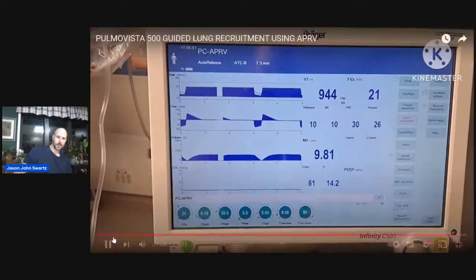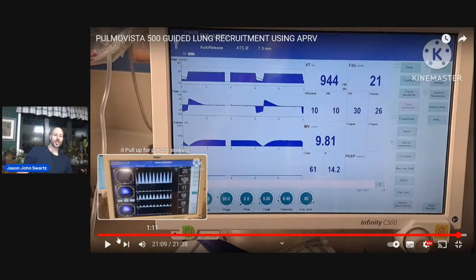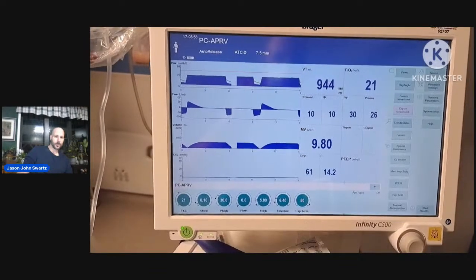Yeah, I mean, I probably actually could have put him at 0, and that probably would have brought him pretty close to the 10 cc's. And then it's like win-win. Everything's good. So perfect. All right.